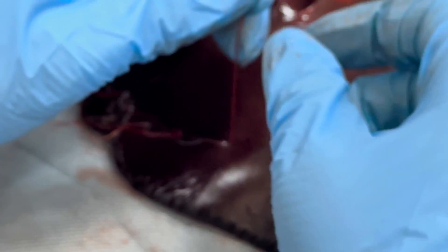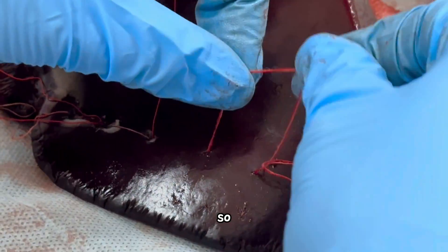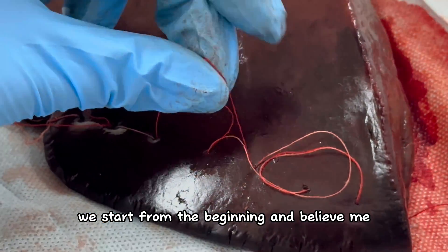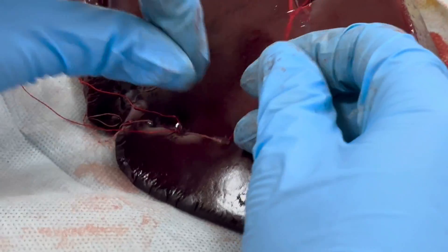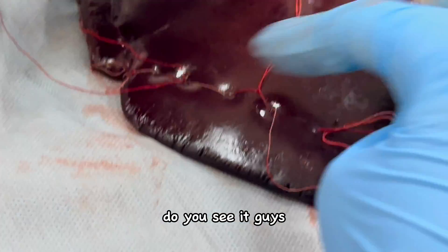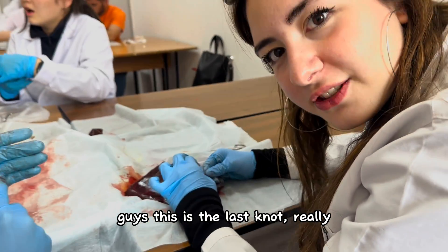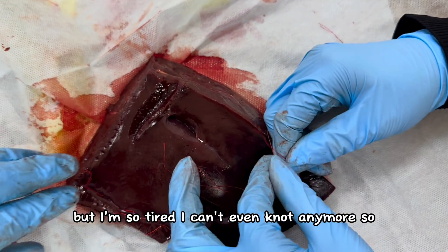We are going really good. This looks so good. As I said, be careful here — if we mess up we start from the beginning, and believe me nobody wants to start from the beginning. My back hurts guys — don't be a surgeon. I feel like if I were a surgeon now I would be like, 'you can live like this.' We are turning to the back side now — this is the last knot, it's really finishing. But I'm so tired I can barely knot anymore.